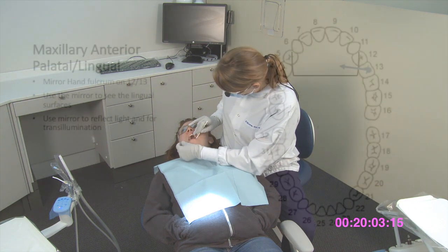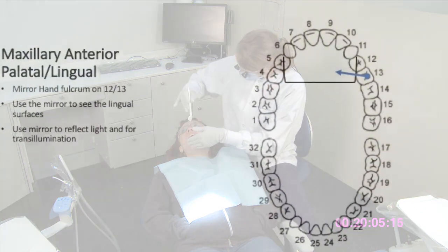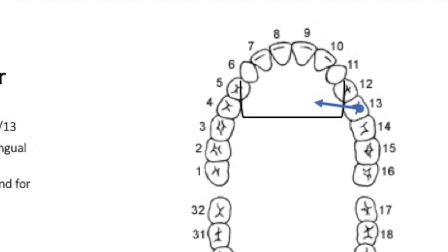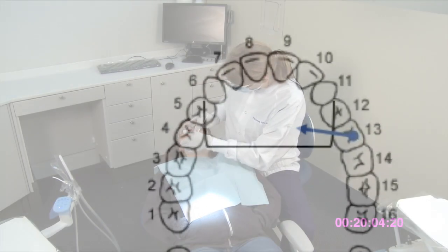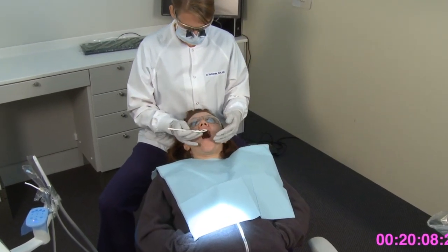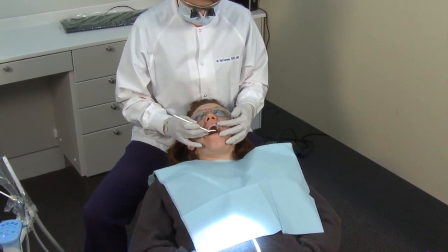Maxillary anterior lingual. The mirror fulcrum is on the left premolars. The patient's head is in neutral with their chin elevated. The clinician will sit between 12 and 12:30.